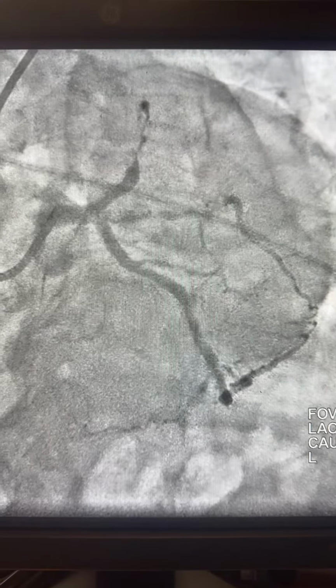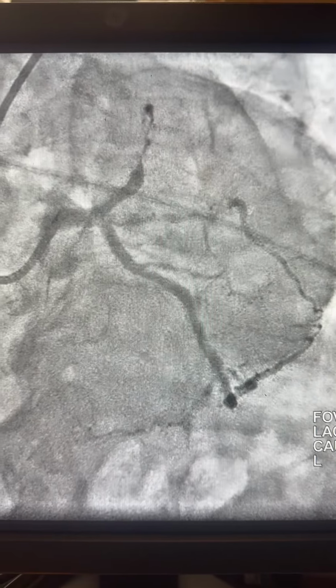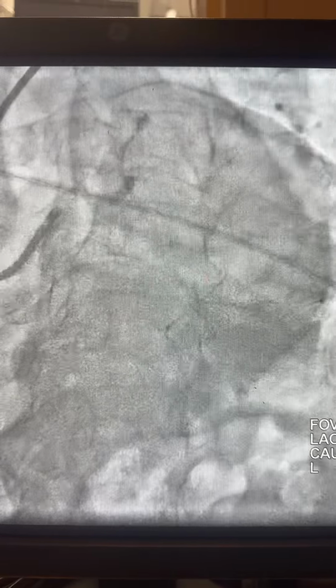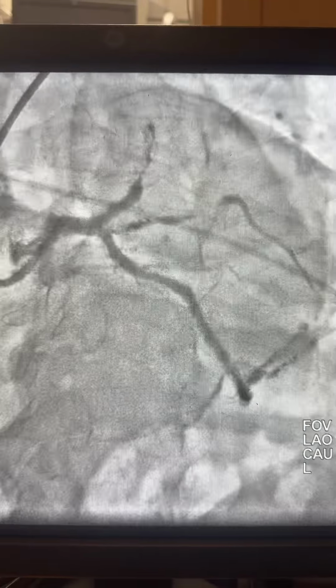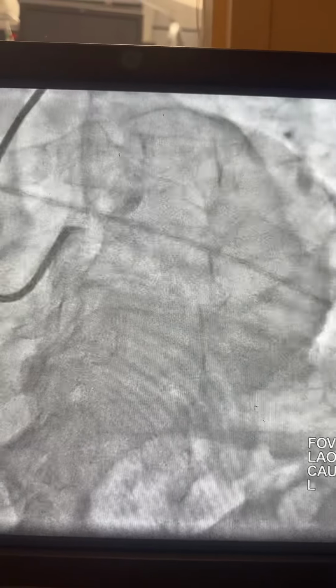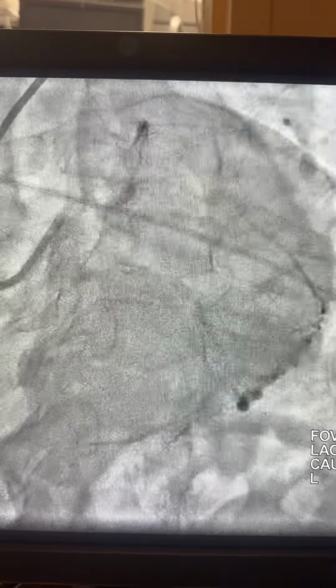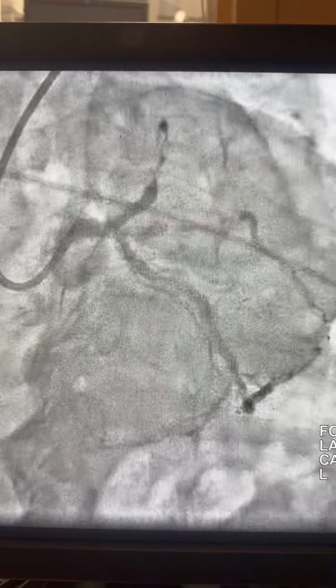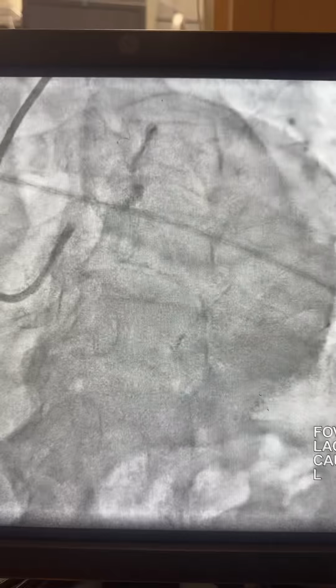A 60 years old male presented with acute MI. The angiogram was done by my colleague and showed multivessel, heavily calcified disease. You see the LAD occluded, the diagonal also calcified and occluded, and this is probably one of the culprits, a big Ramus, also 99%.